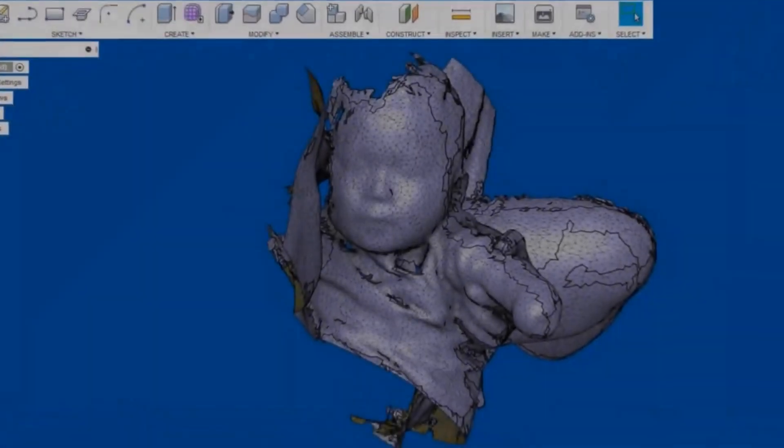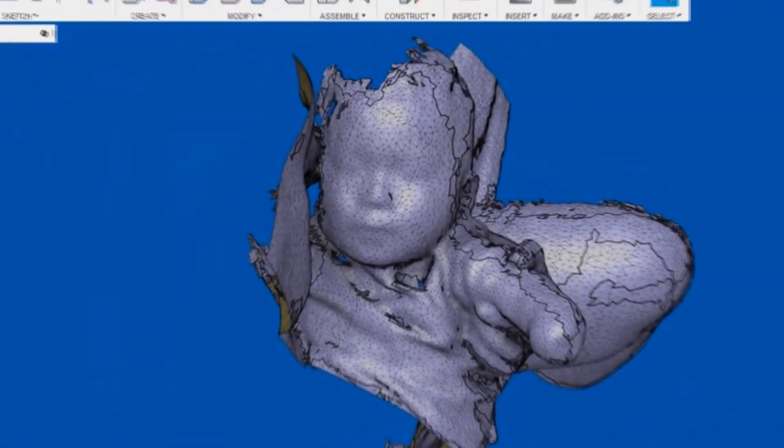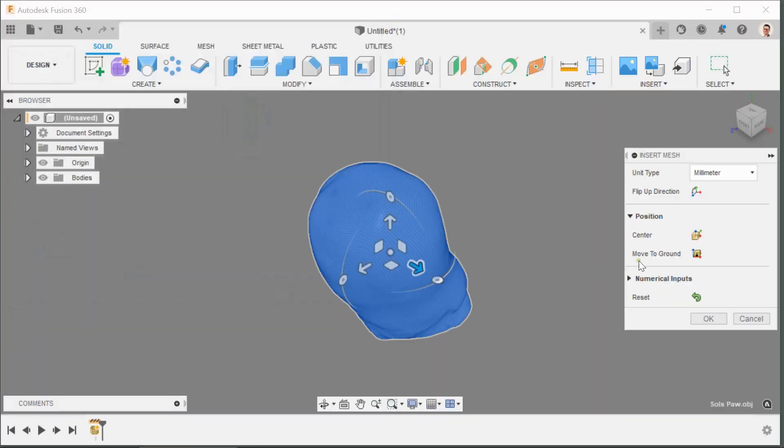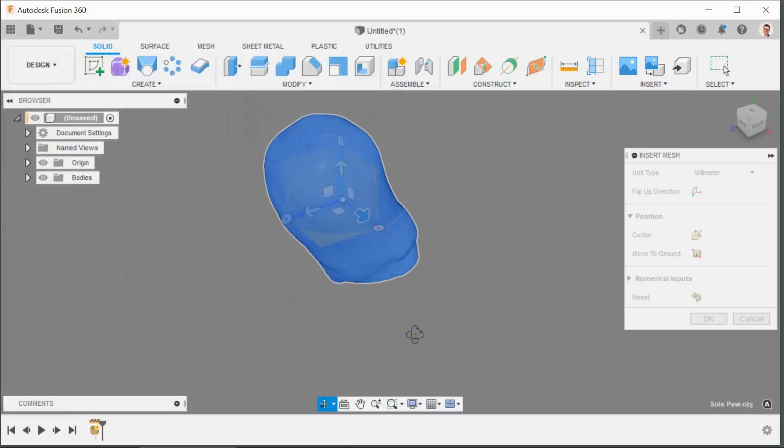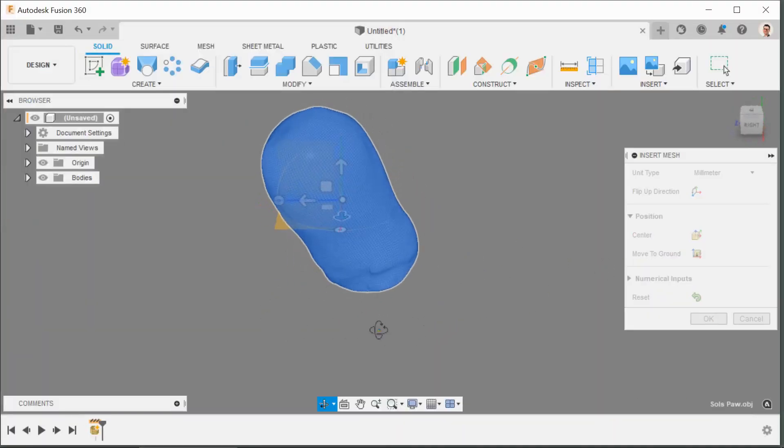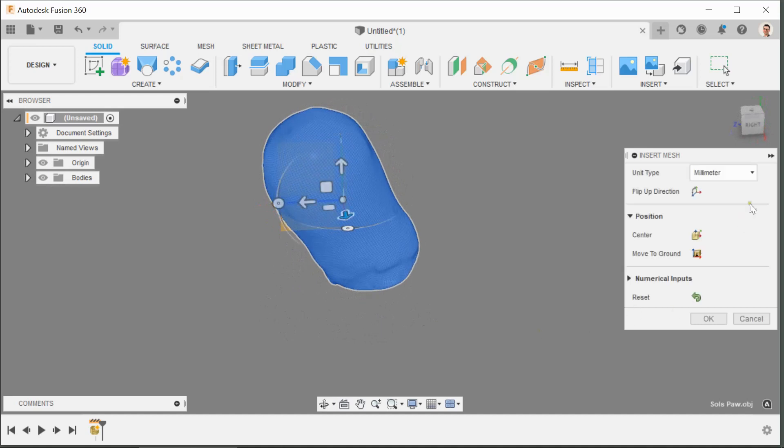Greetings everyone and welcome back to another How To with Ben. Today I'm going to be showing you how to bring in scan data to Fusion 360 to set it up so that you can begin making check sockets.